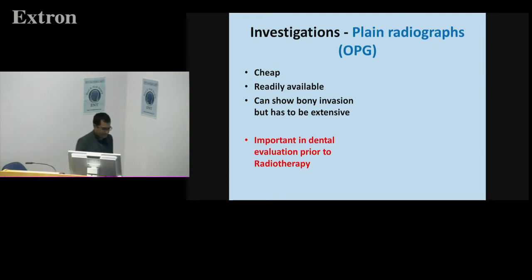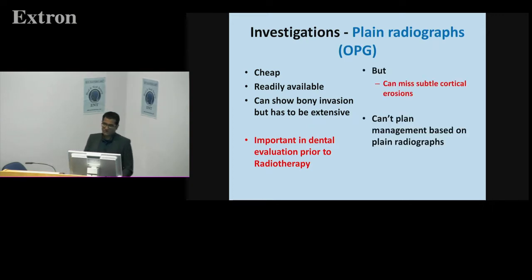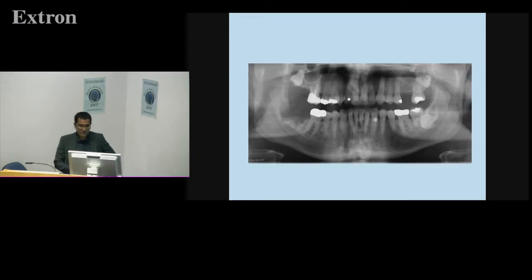We've got a dental surgeon as part of our MDT, and in fact they run a parallel clinic next to us, so it's not so important. But certainly if you work somewhere else where you think there may be a delay, just arrange an OPG, which will speed up the process. It's not really there to look at if the bone's involved. It's not sensitive enough, so you can't really plan your management based on plain radiographs, except to pull certain teeth out.